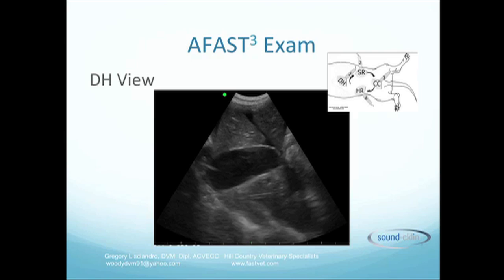We will now start going through the target organ approach with the DH view. As you will see on the cartoon in the upper right hand corner, the DH view is located in the sub-xiphoid region and we go in order from there to the SR view, to the cystocolic view, to the home run view. Since I like baseball, we are basically going around the horn or around the bases, however in a backward direction.